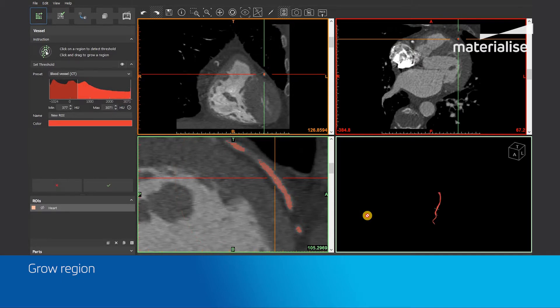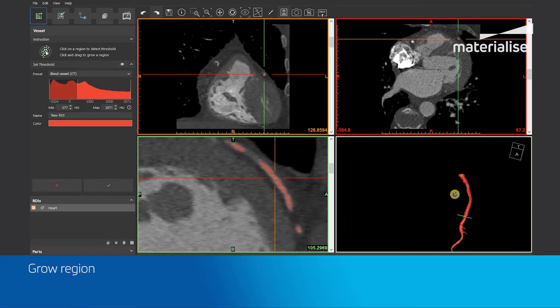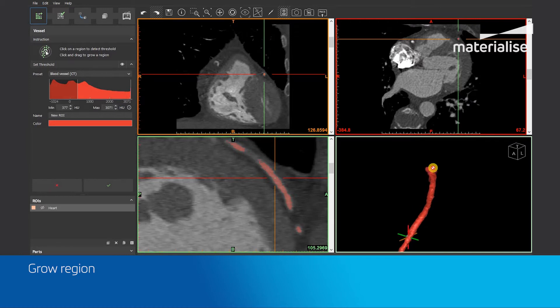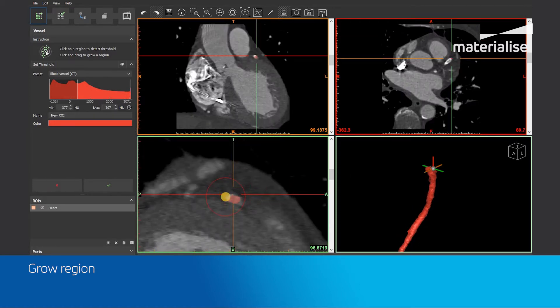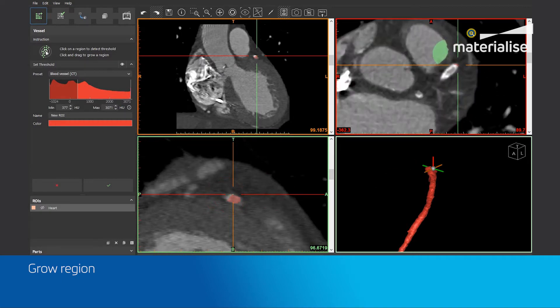When releasing your mouse, the grow operation is done and you can continue with another grow. In between different grow operations, you can define the threshold again if needed. The threshold range will always apply to the next grow action.